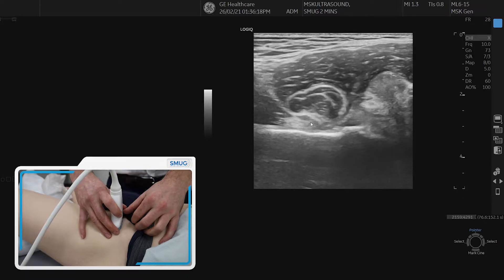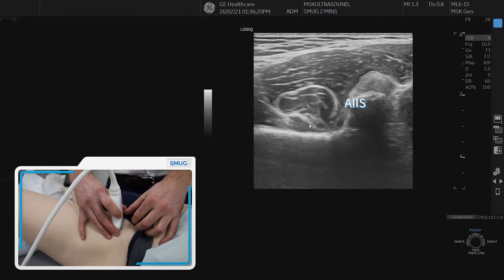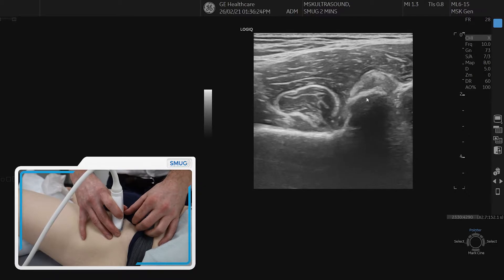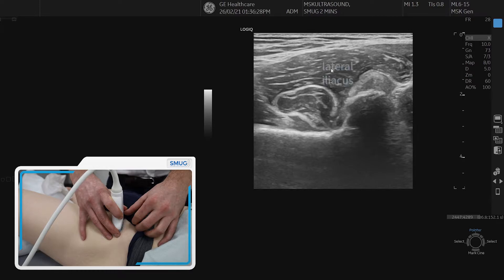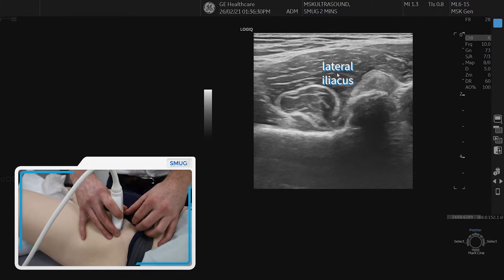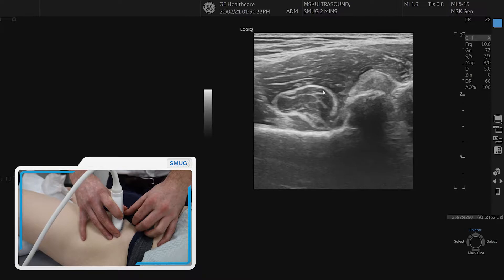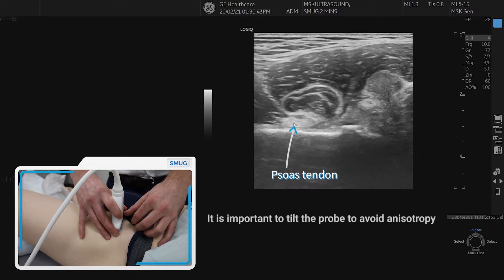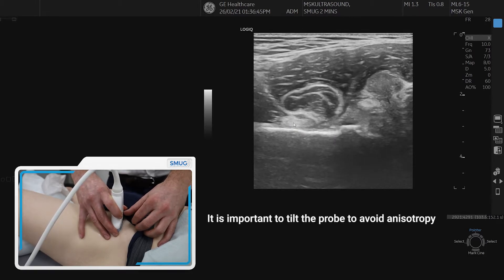It's important to get our anatomy correct here. You can see the AIIS on the right hand side. We can also see just superior to that the lateral iliacus muscle belly, and then just underneath the hyperechoic line, which indicates the intramuscular tendon, is the medial iliacus. And just under that is the psoas tendon. It's important to tilt the probe to get the tendon nice and bright.